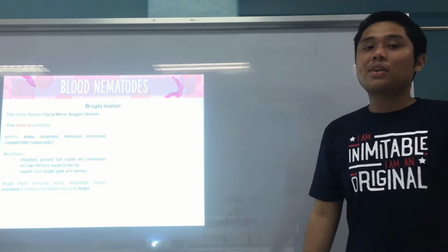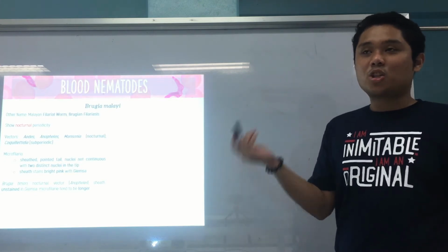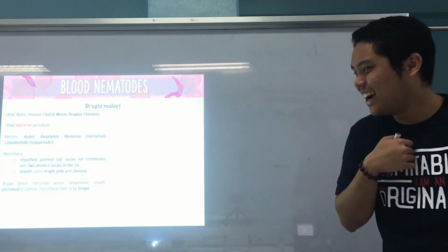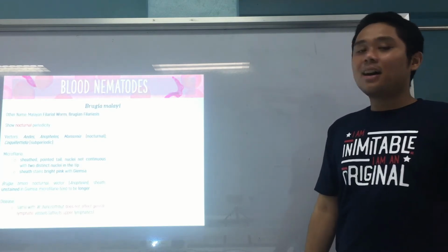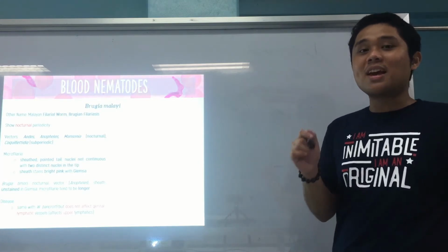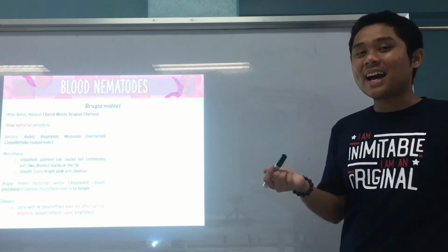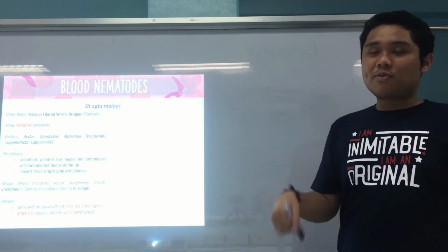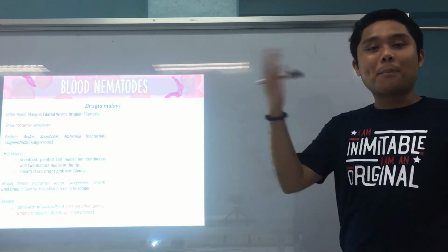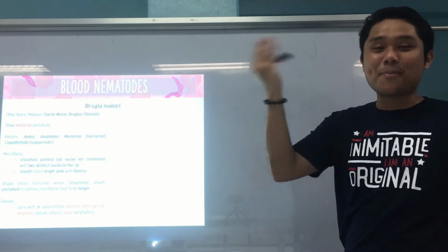And lastly, the microfilaria of Brugia timori tends to be longer, so it's bigger. Okay. The disease is still the same as with Wuchereria bancrofti, but for Brugia malayi, the microfilaria do not reside in, or don't favor, the lymphatic vessels near the genitals. So they like the upper lymphatics. They are at the top. They like the upper lymphatics.